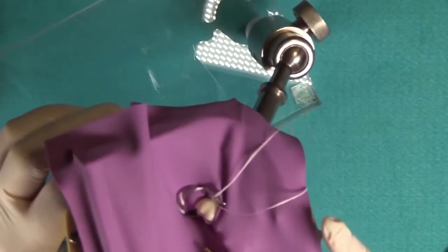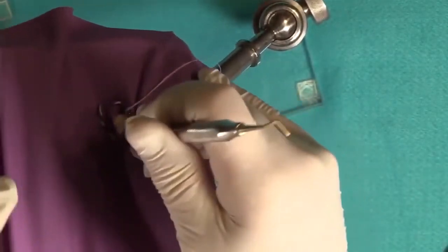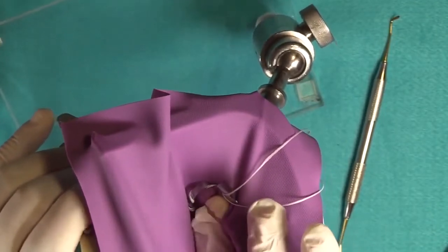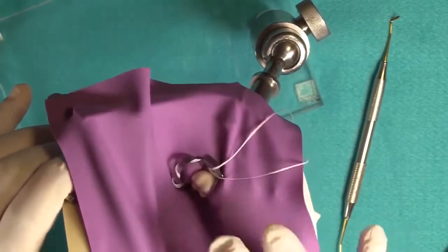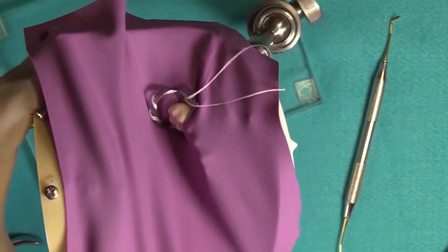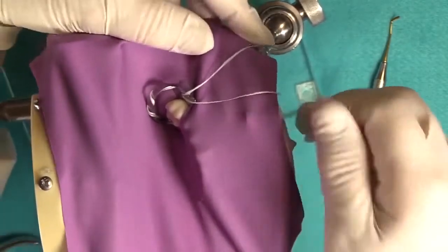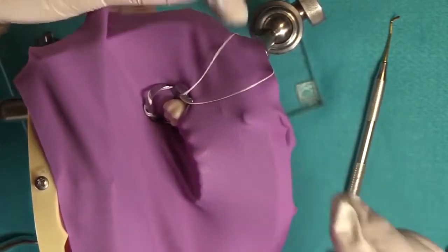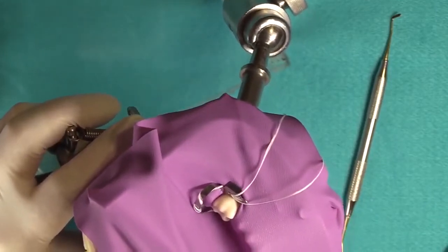Perfect. Now, you can turn the instrument in the other direction and go this way with it, or on the lingual you have more room, so you can also use a finger to pull this off. But when you pull it, you want to pull sideways until it clears the wing, because if you put too much downward pressure, you're going to tear the dam as well. So now I heard there was like an audible little click as it popped off of there. Yes, exactly. So then now we're okay. See, everything is sealed off and we're ready.